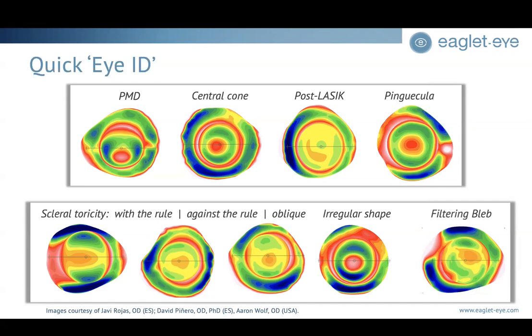And again, that's another reason why it is very, very important to get a good look at comprehensive ocular shape before making decisions on fitting a lens, because in some cases, just because we have corneal astigmatism, for example, does not mean when fitting a scleral, we need a toric haptic. In a lot of cases, it does.